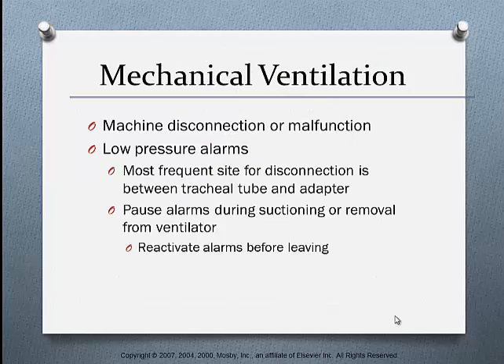So we have a low pressure alarm. The most frequent site for disconnection is between the tracheal tube and the adapter. So if a patient has become disconnected from the ventilator, it'll alarm low pressure. You want to pause those alarms during suctioning or removal of the ventilator and reactivate those alarms before leaving the room.